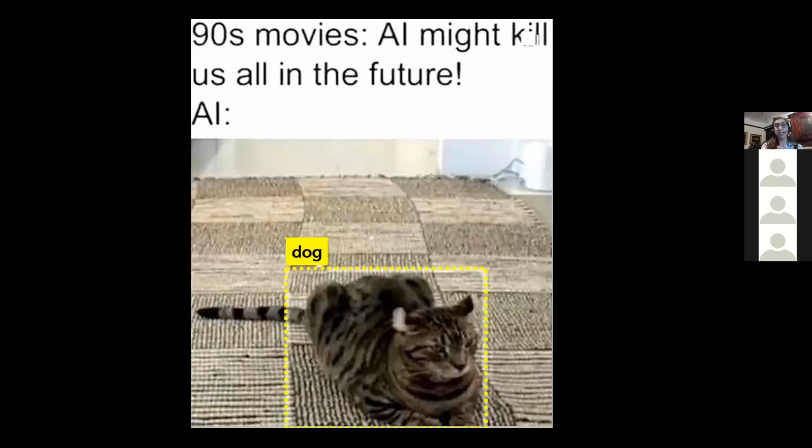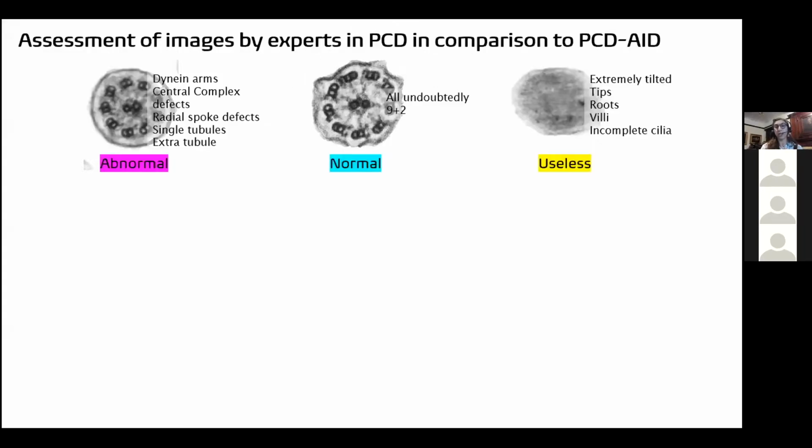But for this, there was another thing that we can do, and now I'm going to show you another strategy that I found. I talked to you about the numbers of cilia that we put, but there's another thing that we can do to see if our machine is doing well. And one thing is auditing the machine.